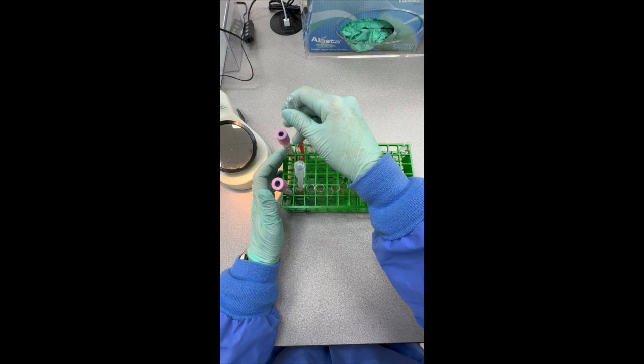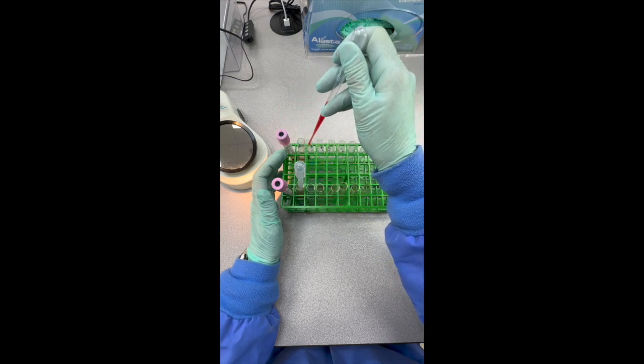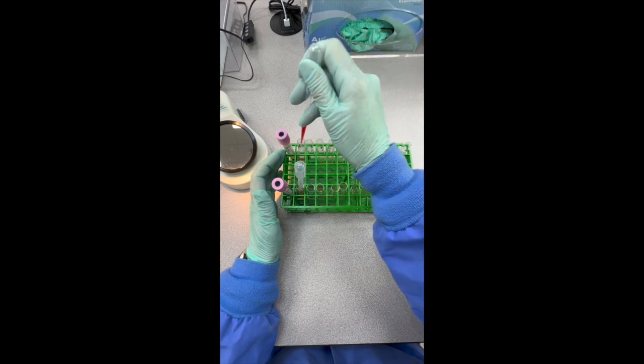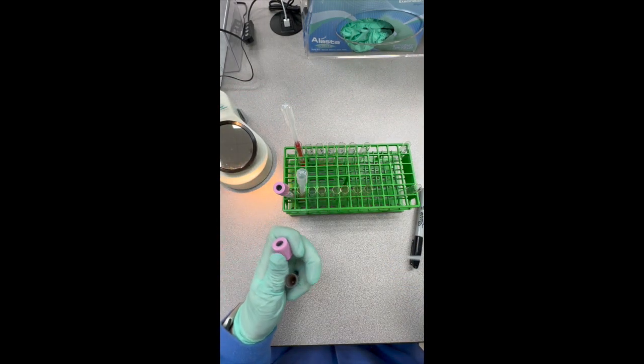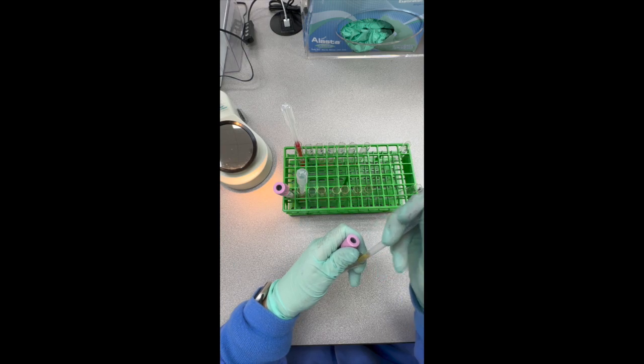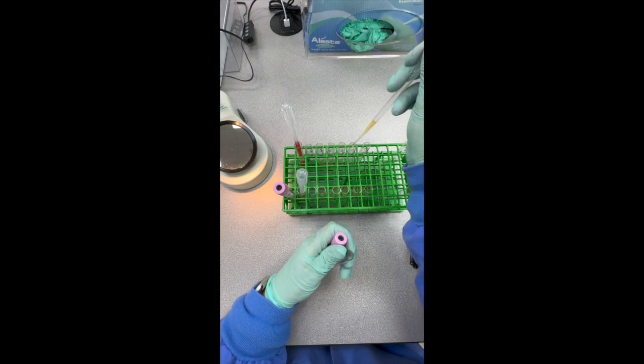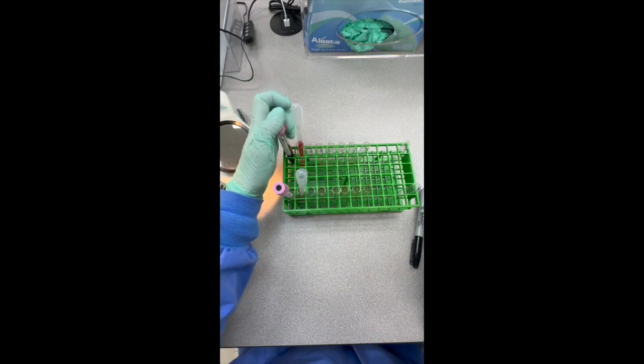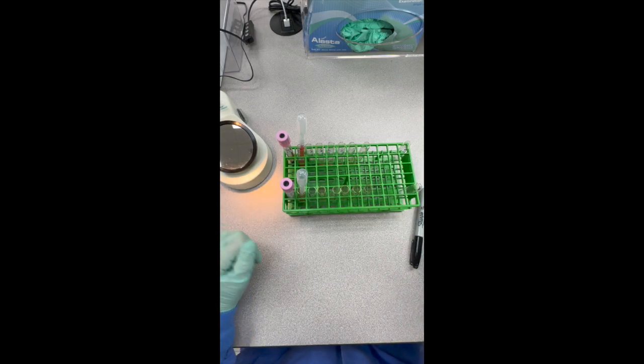We'll set up these ones, mix up that cell suspension. One drop into A, B, D, and C. Very good. Now we'll put some plasma into our back type, 2 drops in there. Excellent. All right, now we're going to put them in our centrifuge, 15 to 20 seconds, and we'll be back to read.